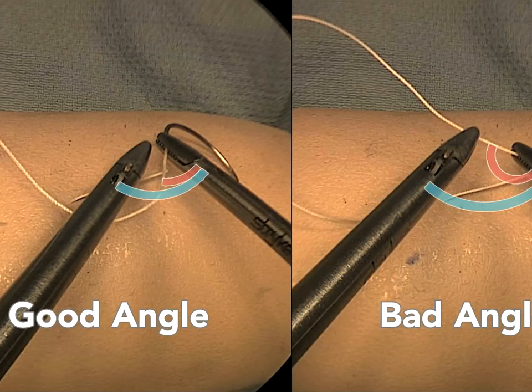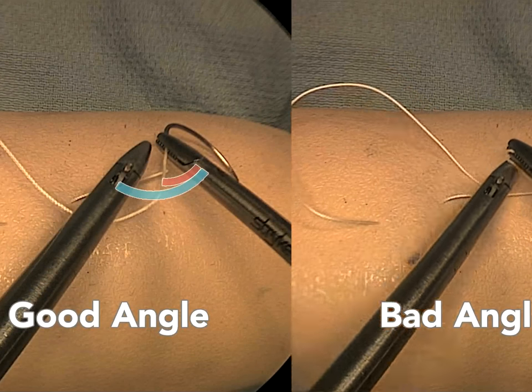Here, in contrast, the 90 degree blue instrument angle is much smaller than the red suture angle, and most unfavorable for knot tying.